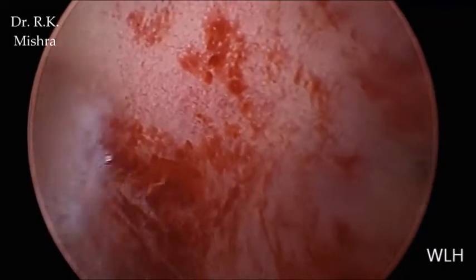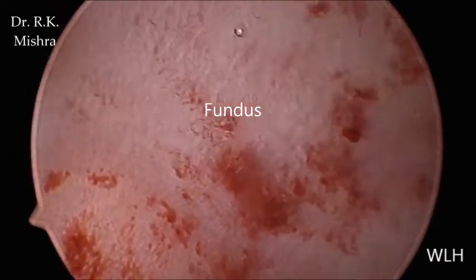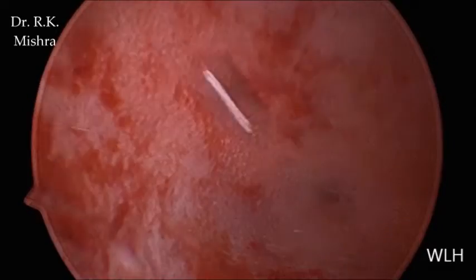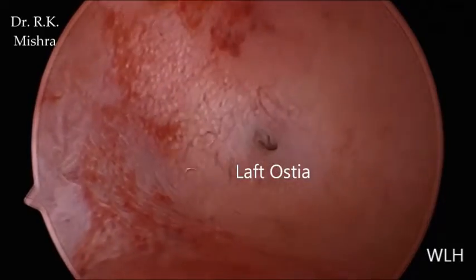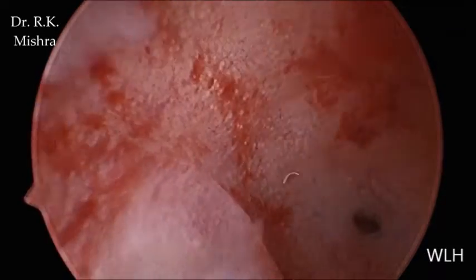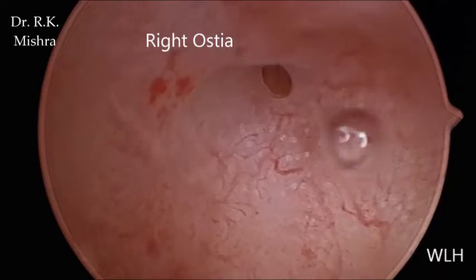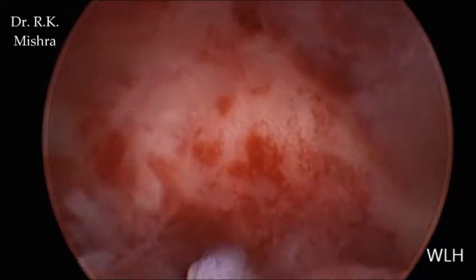Here we have the fundus — this is also quite normal. There are a few bubbles there. This is the left ostia, which appears to be normal. A little contraction we can see, and then this is the right ostia.